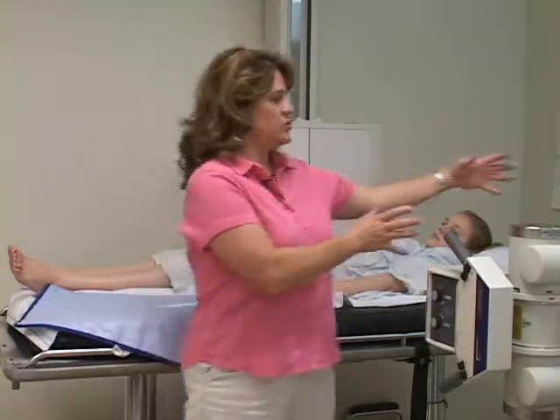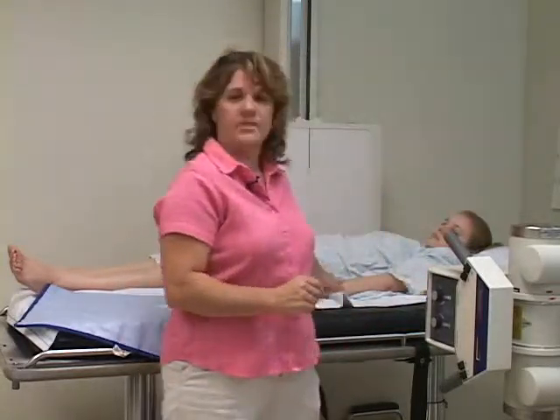I'm going to demonstrate how to do a dorsal decubitus. Typically this is done for abdomen films. However, I have seen it done occasionally for chest. Basically, when you do these films, you want to bring the patient in on a gurney. You're going to get your tube actually lined up with them first, and then you're going to do all the rest of the fiddling. This is kind of a difficult exam, and it takes a lot of tweaking to get it right.